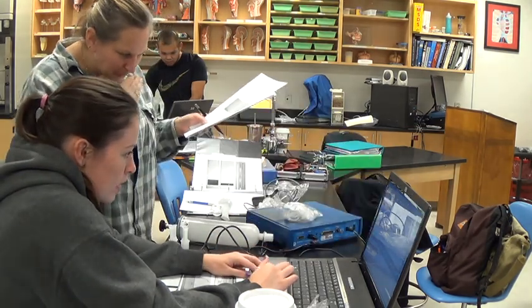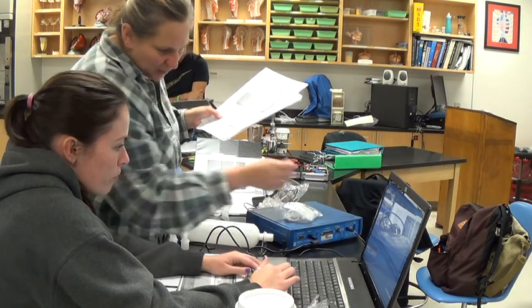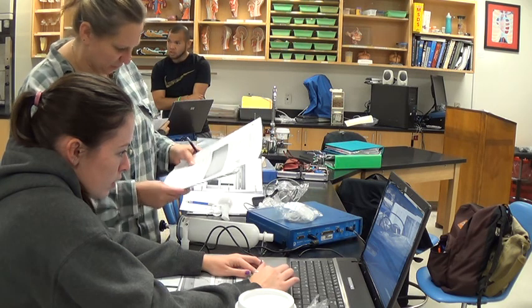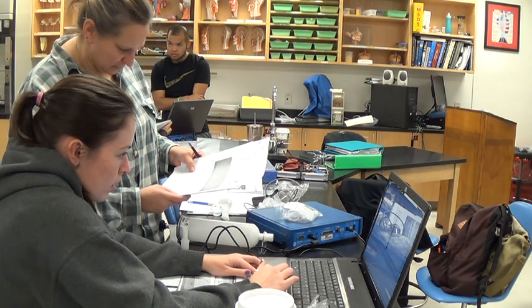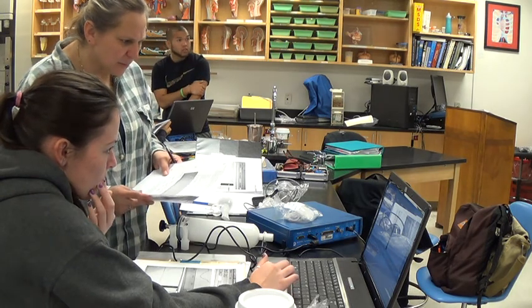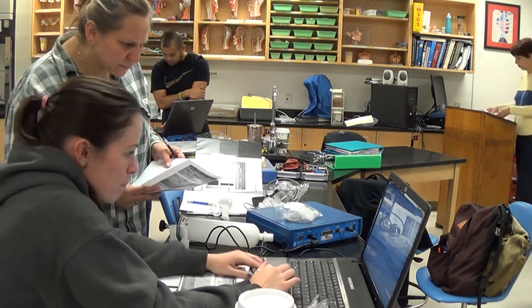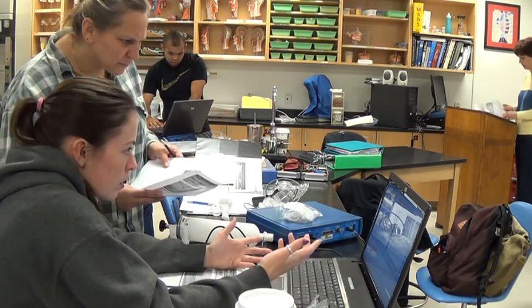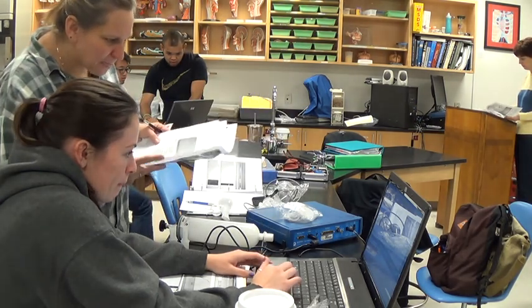Normal is okay. You tried. It's more experimental, I think, than your actual lung condition. Normal has to be 1, 2, 3. I think that's the normal one. She wasn't lying. So pretty much 26%. I know. FEV1 was 3.7. You suck. That's what it is. That's the only difference, liters.